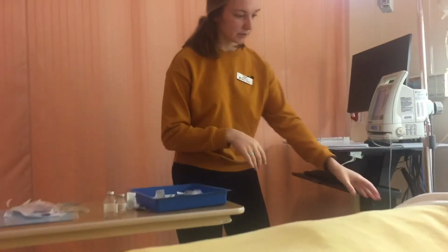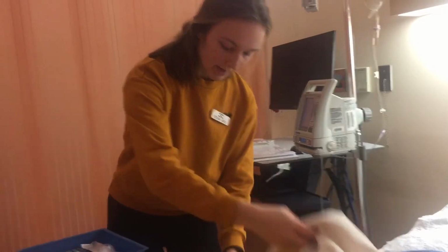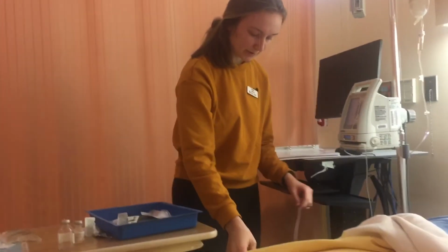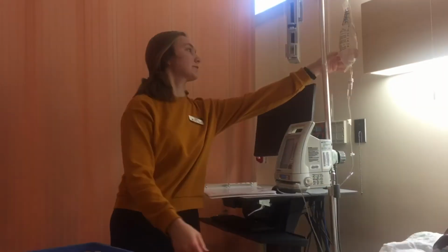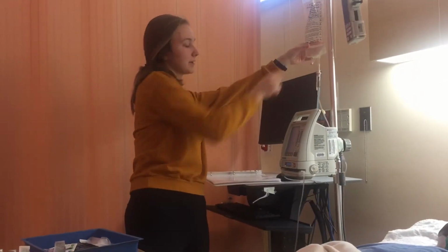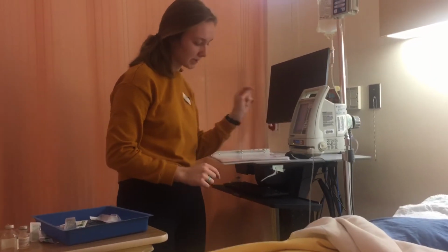Can I just take a look at your IV? So I'm just going to look at the IV site to make sure it's not red or swollen, and it looks good. And now I'm going to check the tubing to make sure that none of the clamps are done up, and make sure it's running, make sure the right primary bag is infusing, and make sure that the primary bag is infusing at the correct rate, which it is.